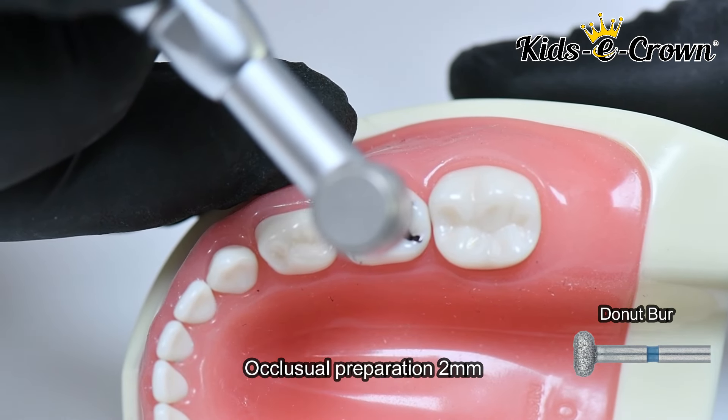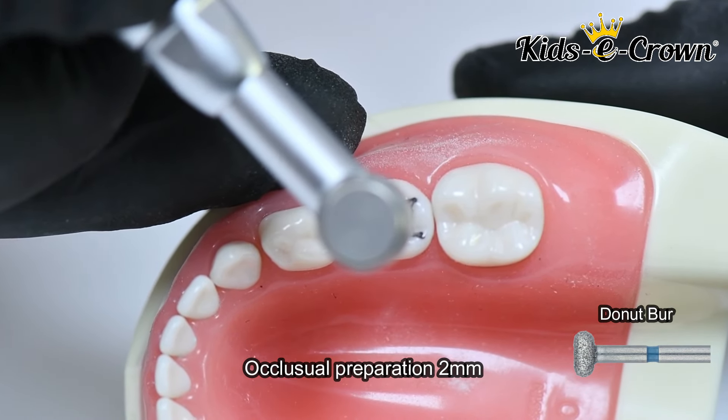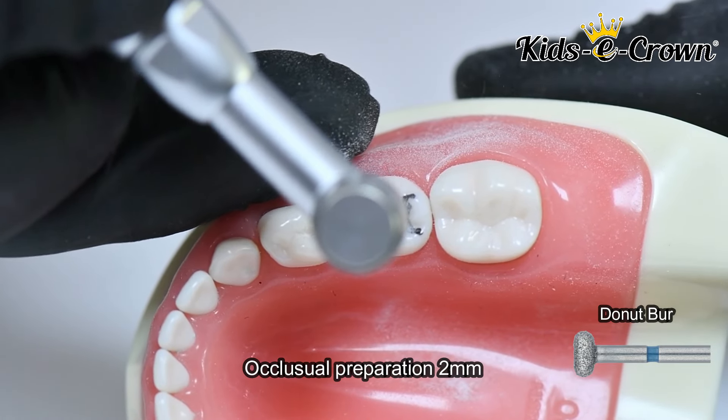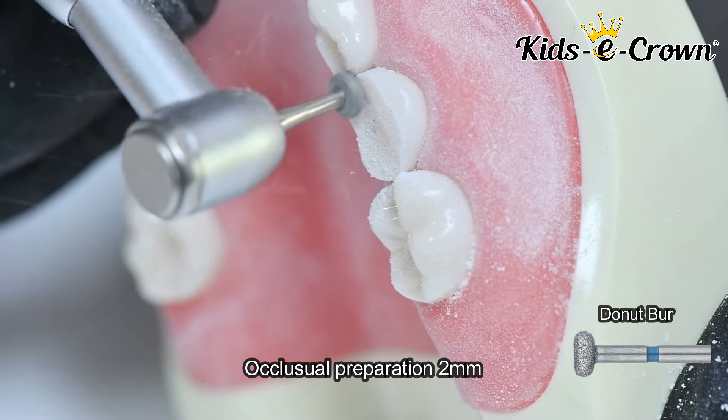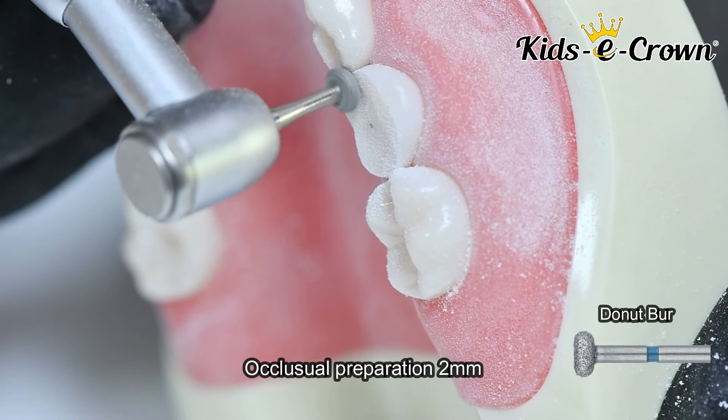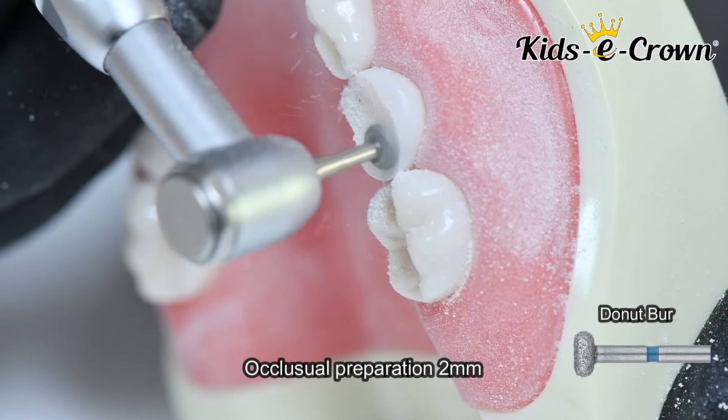The first step is occlusal flat preparation using a wheel or donut-shaped burr. The thickness of the preparation is 2 mm. The occlusal flat preparation is made because kidsy crowns are flat from inside.